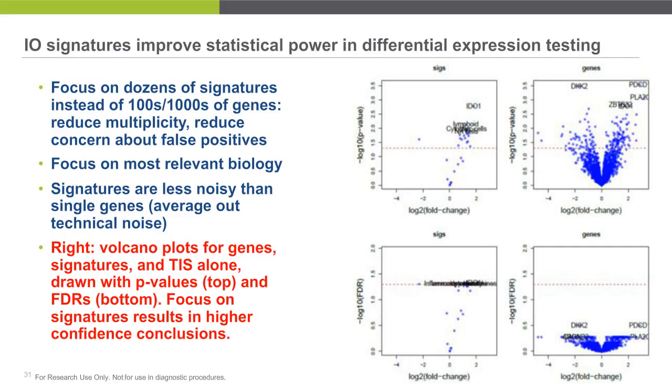So we perform a false discovery rate correction and obtain the volcano plots on the bottom. If you look at the signatures, now plotting FDR on the vertical axis, false discovery rate instead of p-value, we find that many of the signatures end up with a false discovery rate just around 0.05. It happened to be a little bit below, but that's not really the point here. The point is about half our signatures, we've got a pretty strong conclusion to be made.